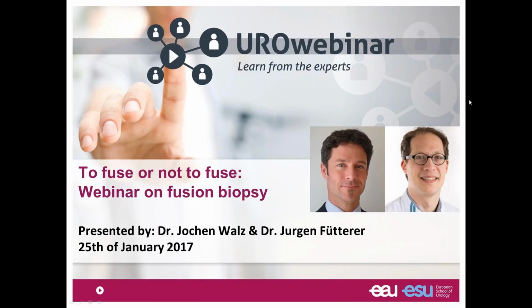And I think indeed at that time point an MR fusion biopsy or an MR-guided biopsy is of special interest, because this is then really the possibility to get most out of the system and gives you most information about the cancer characteristics and helps you to select the low-risk patient for active surveillance and sort out those patients that have a higher grade disease or high volume disease and shift them to active treatment. So I think this is indeed the most interesting use of MR right now in our daily practice, because it really changes the management of the patient.